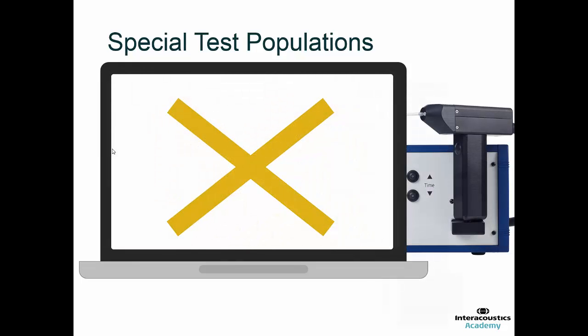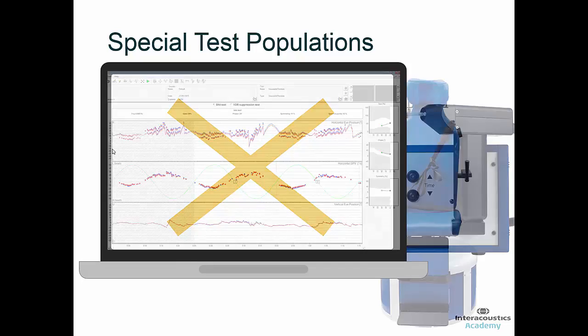What you'll find is that the caloric test is looking for symmetries between the right and the left side. If there's only a mastoid cavity on one side, then the heat transfer will be different. It's also dangerous to put water into the ear, as that could cause infection, so the caloric test is contraindicated. Therefore, if you only relied on having a caloric test in the vestibular laboratory, then you're not going to be able to make a diagnosis on this patient if they have a pathology affecting the lateral semicircular canal.